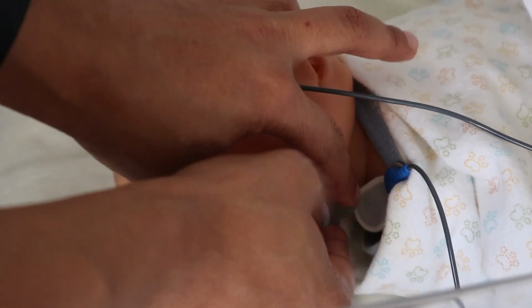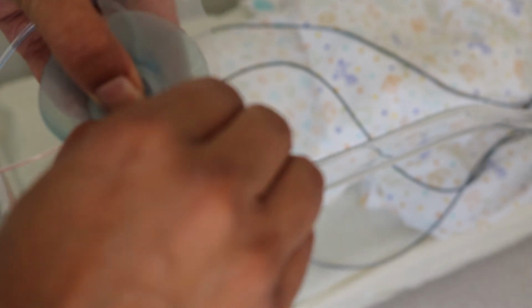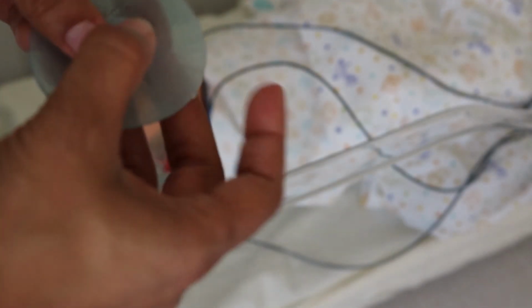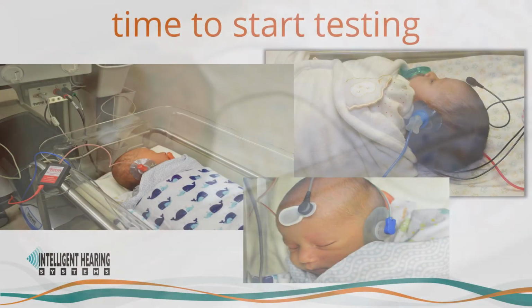Flatten the earhugs to create a seal around the ear. The earhug does not need to stick on the hair or be folded around the ear. It is important to create a seal on the pinna. Since the earhugs are flat, you can certainly place the baby's hat on before testing.